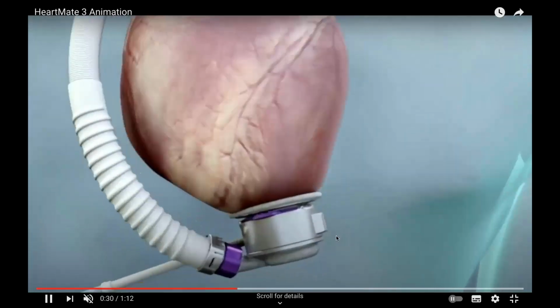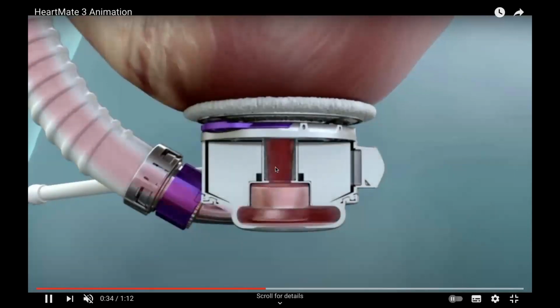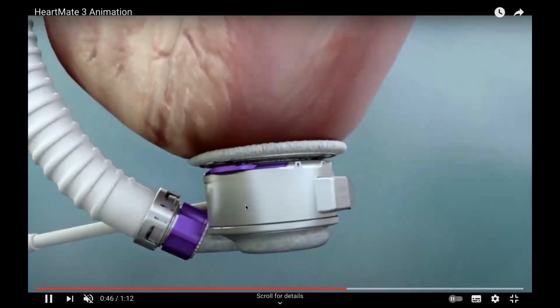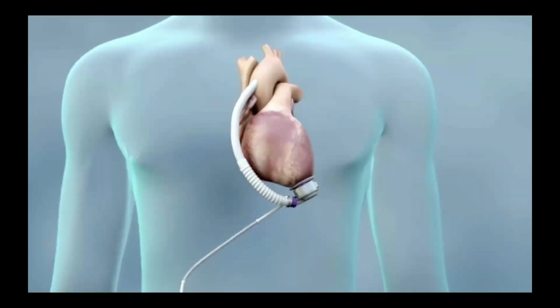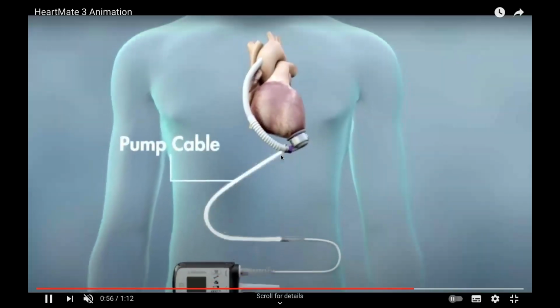Now, if we look inside the machine, this is the direction of the blood flow. The blood is getting sucked out of the ventricle. This is the rotor, and it's a rotary pump. And you can see it's a continuous flow. There is no pulsing, compared to the Berlin Heart, which was a pulsatile device. This is a continuous flow device.